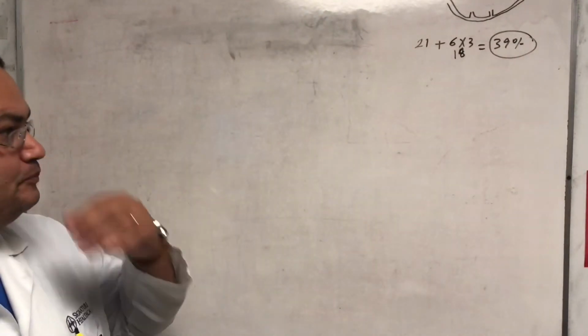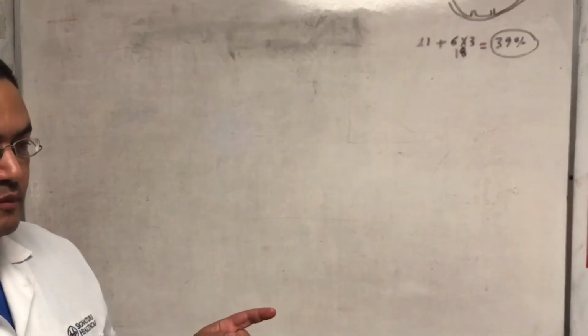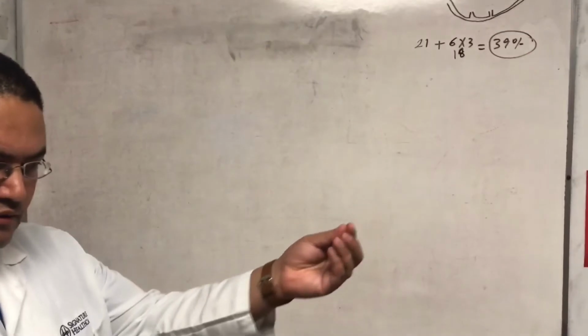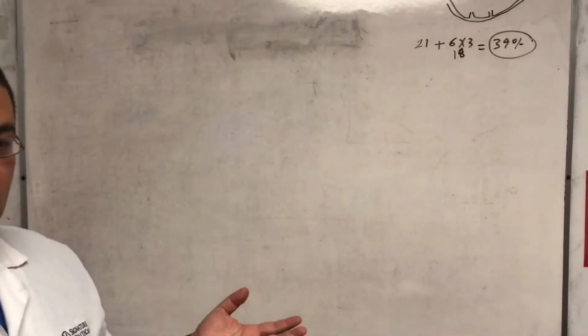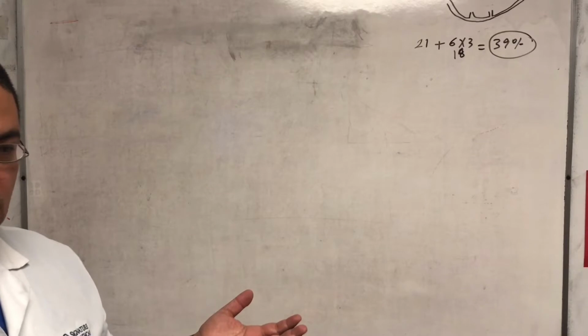So let me ask you this. The 6 liters per minute is 100% oxygen, 6 liters coming from the wall. This is not mixed, it's 100% oxygen. How is it becoming 40%? Does that have to do with dead space?